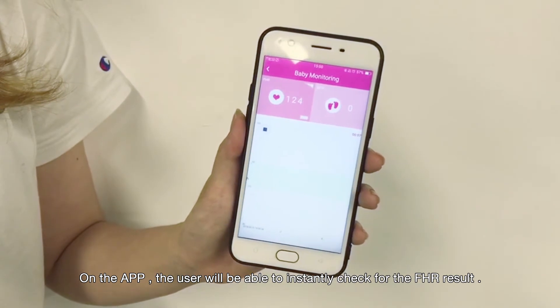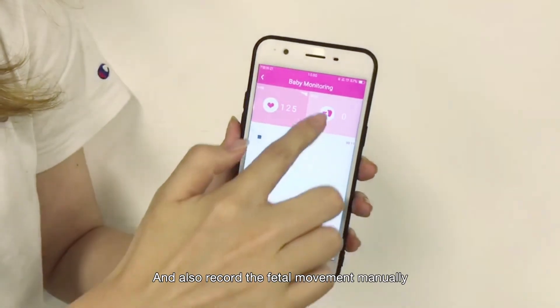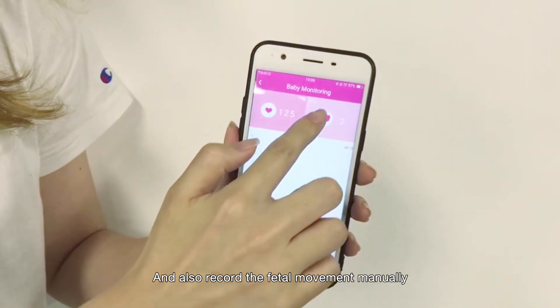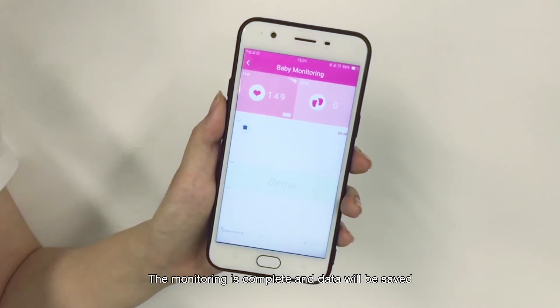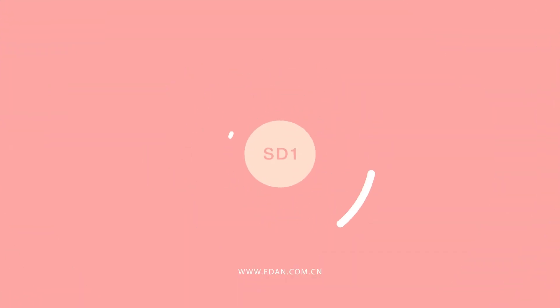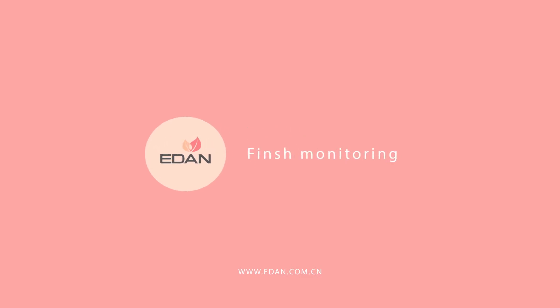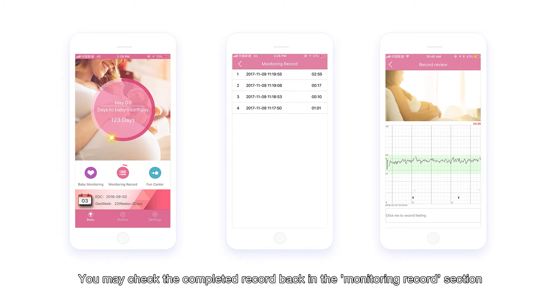On the app, the user will be able to instantly check the fetal heart rate result and also record fetal movement manually. Once you are done monitoring, press stop. The monitoring is complete and the data will be saved. You may check the complete record in the monitor record section.